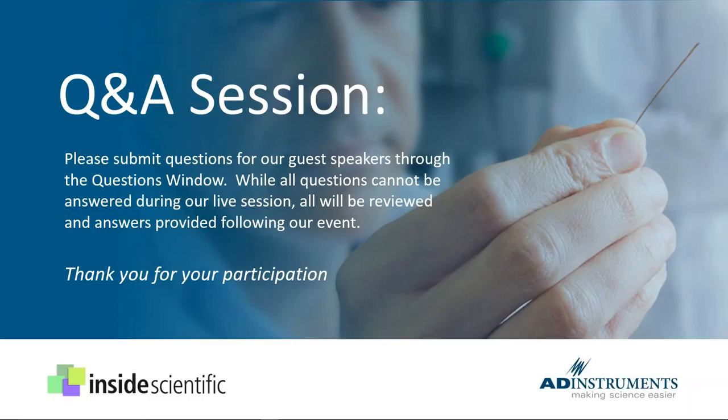Sure. I would say for me, what I would consider the gold standard is a transit time flow probe. Okay. So transit time flow probe, thus giving you the ability to look into some of the time-varying calibrations that you also talked about, Jim, and applying a full absolute volume calibration for their PV data? The transit time will give you a stroke volume. If you want the absolute volumes of the ventricle, you would need a hypertonic saline. But the transit time alone will give you the cardiac output and the absolute stroke volumes.